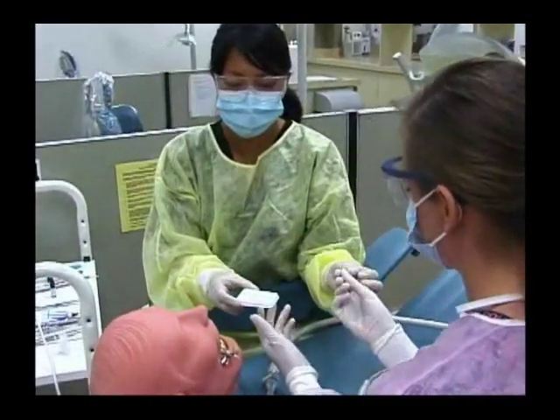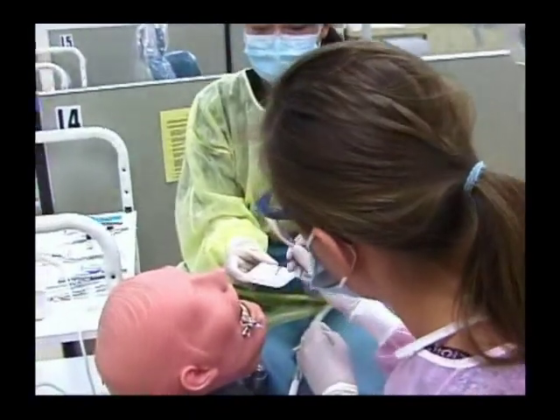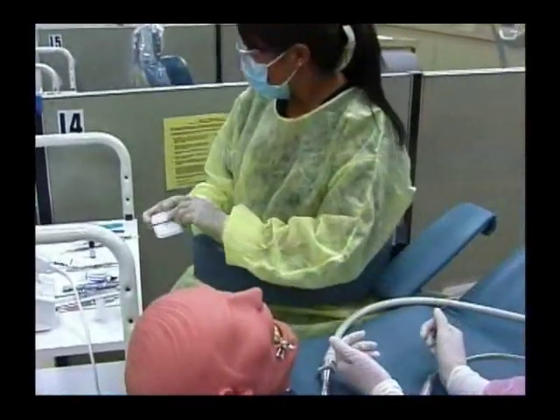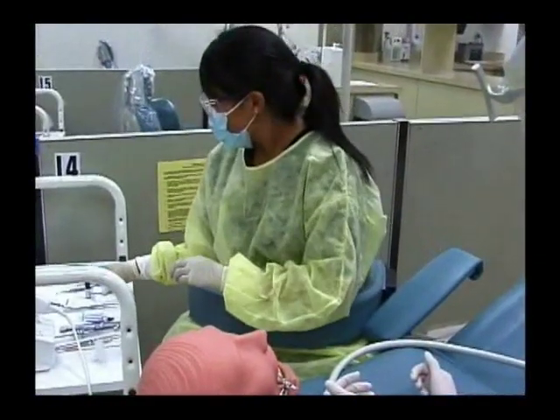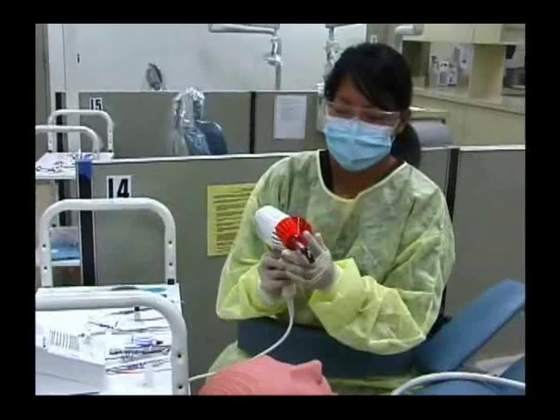Then we'll place the bond on the tooth. Once we place the bond, we'll need to cure it with the light curing device.